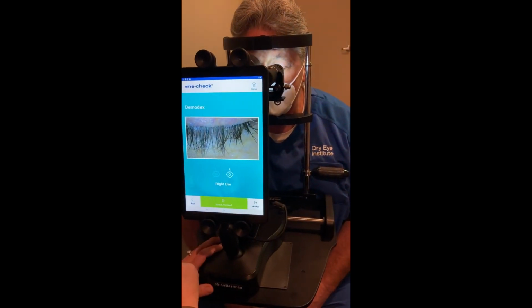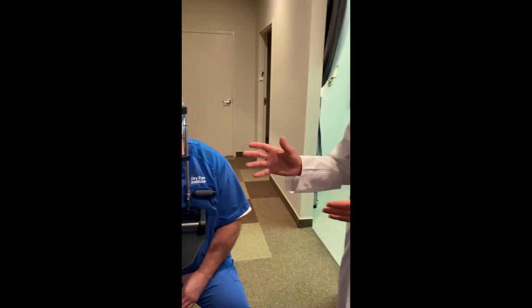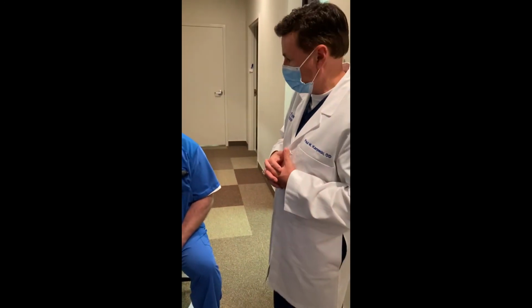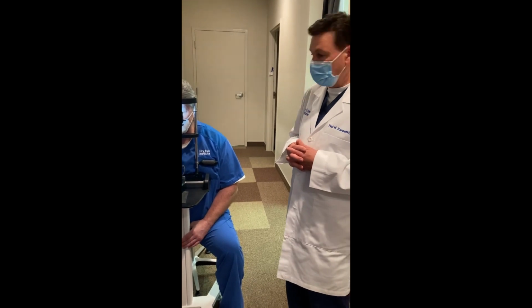And by proceed, we have a lot of options. I could email this to the patient, or we could put it in our EHR as an anterior segment photograph, which is billable, especially in this case, given the symptoms that we captured in the OSDI-6. So excellent technology, both for meibography as well as for external eyelid imaging. So you're able to completely capture blepharitis, whether it's MGD or external eyelash blepharitis.